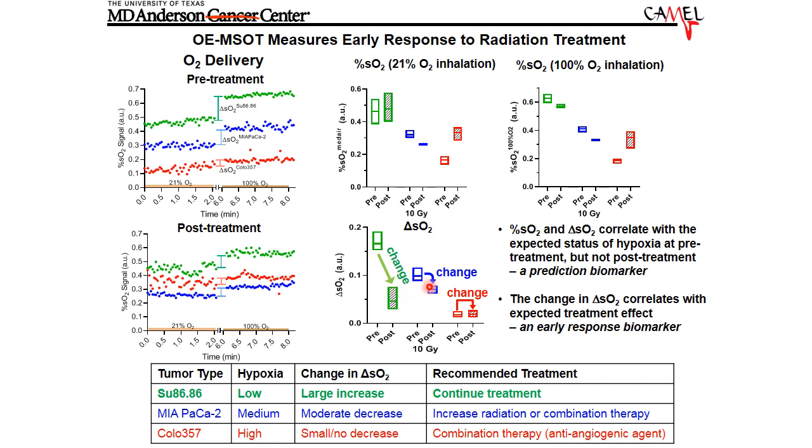The mildly hypoxic tumor changed somewhat, and there was no change within the hypoxic tumor. In other words, the hypoxic tumor is hypoxic. It doesn't have any capacity to take up more oxygen when you give it 100% O2, and that really didn't change with the therapy. We didn't cause any therapeutic effect. The normoxic tumor does have much less capacity to take up more oxygen.